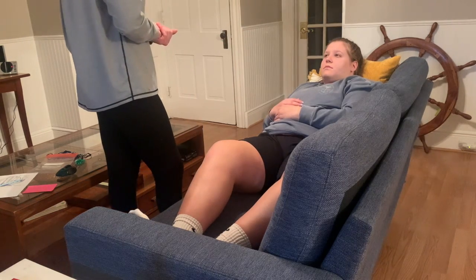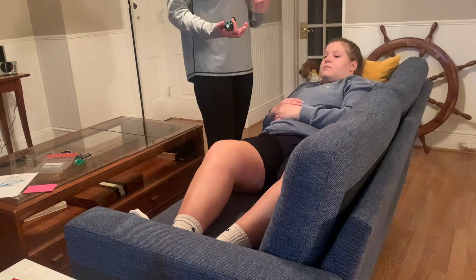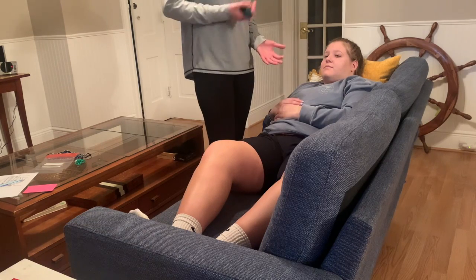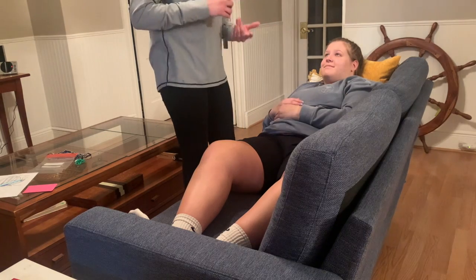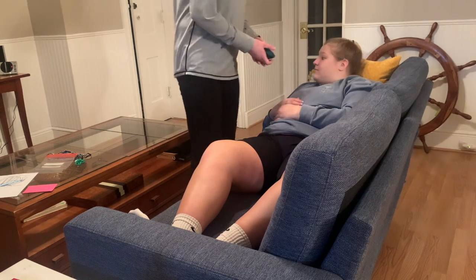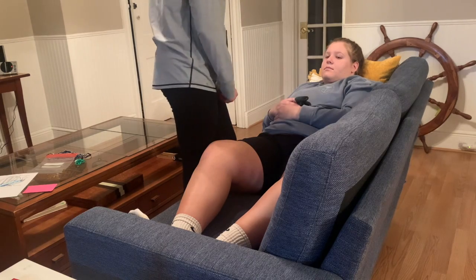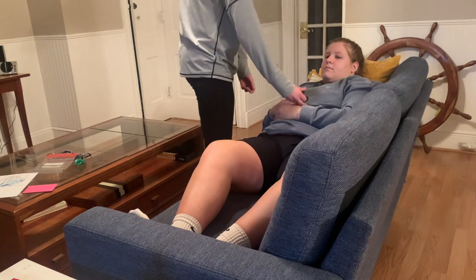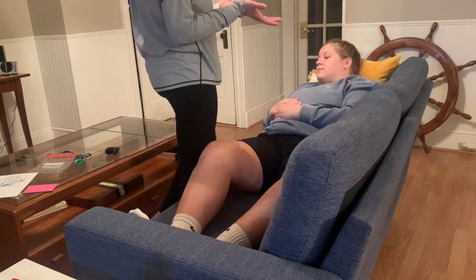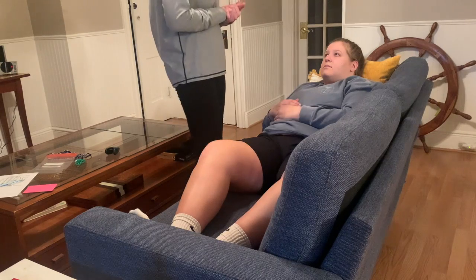From there, I'm going to get a pulse ox reading. Since she has her fingernails painted, in a real setting you would sometimes have to have the patient remove their nail polish if you couldn't get a reading. When you do this, you want to make sure you're not using the thumb and not using any finger that has a wound or edema. So I'll use this index finger, leave it on, and you can just relax your hand. We're going to say her oxygen level is a little low — at 89. Ideally you want oxygen above 95. Her pulse is 88.